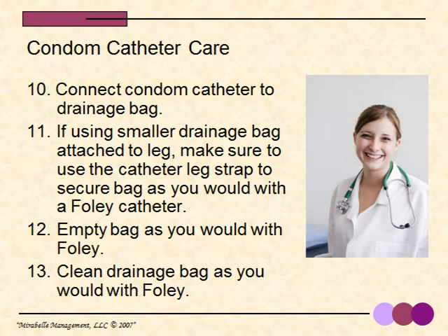And if using a smaller drainage bag attached to the leg, make sure to use the catheter leg strap to secure the bag as you would for a person who had a Foley catheter. And you empty this drainage bag the same as you would with a Foley. Clean the drainage bag also as you would with someone having a Foley catheter.